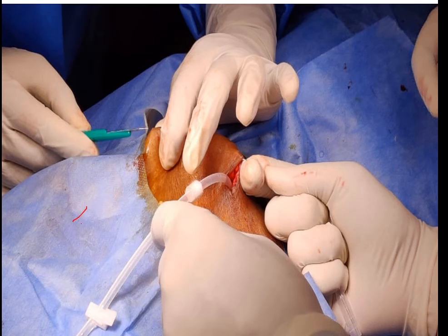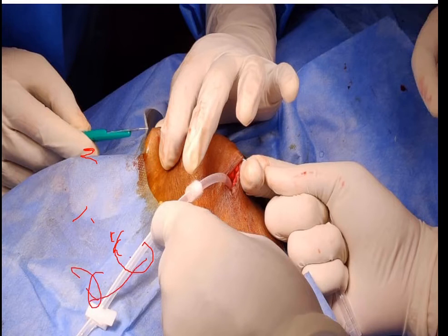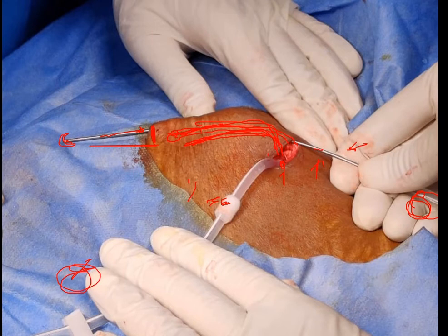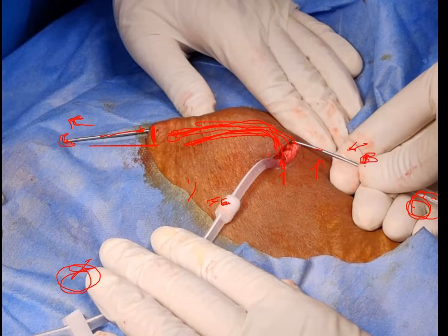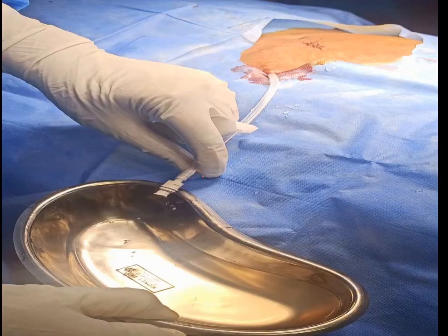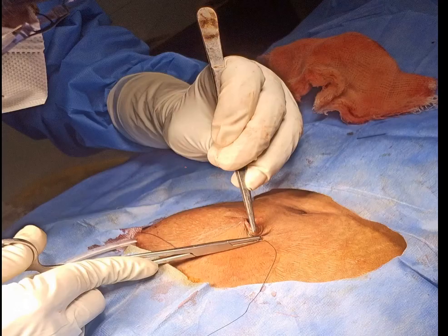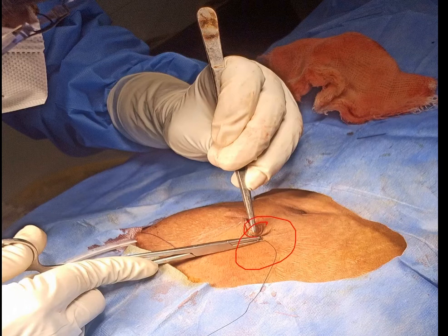Once the tunnel is made and comes out, the catheter end is connected to the back end of the tunneller and brought out through the exit site. The catheter's distal end — which was external — is connected to the back part of the tunnel and pulled through so it exits at the designated exit site on the skin.